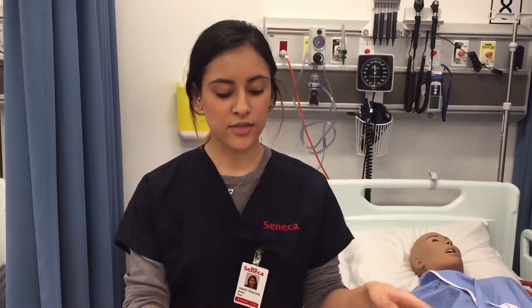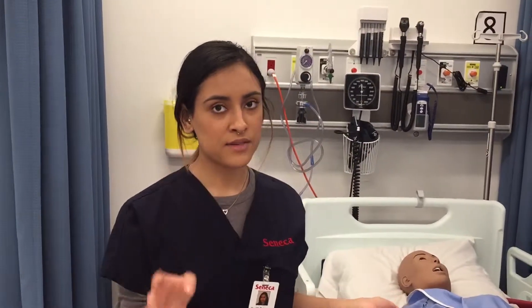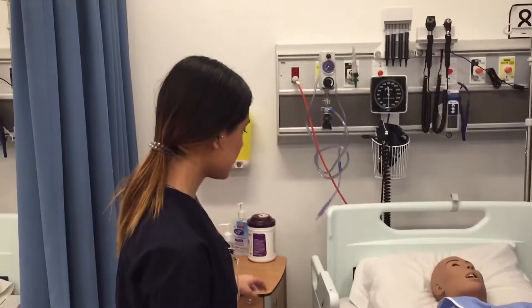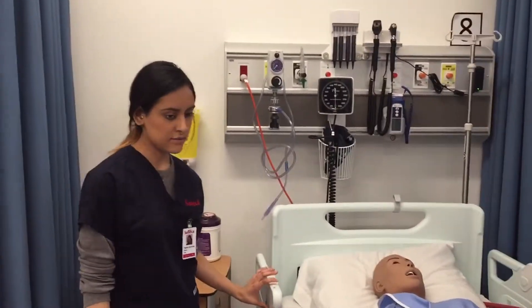Hi, my name is Shazia. I'll be performing catheterization on my female patient. I've checked her charts and I know what size catheter she used and I brought that all out. I've also obtained consent from my patient and provided privacy for her. So before I start, I'm going to make sure she's okay and comfortable.